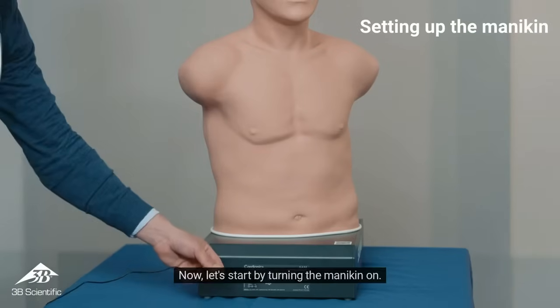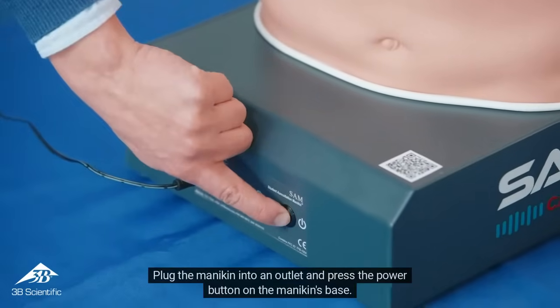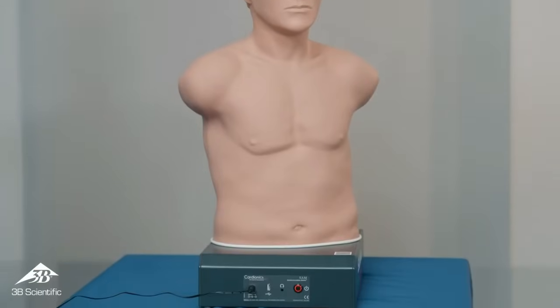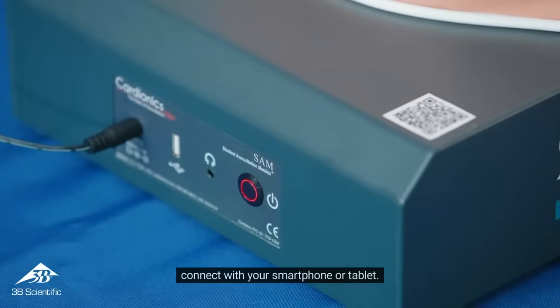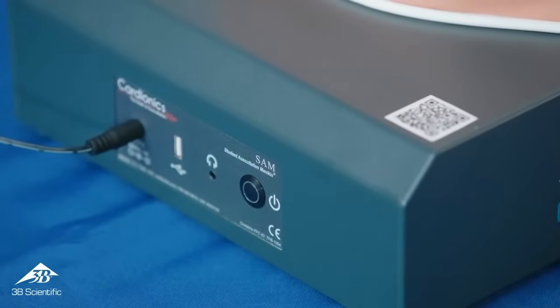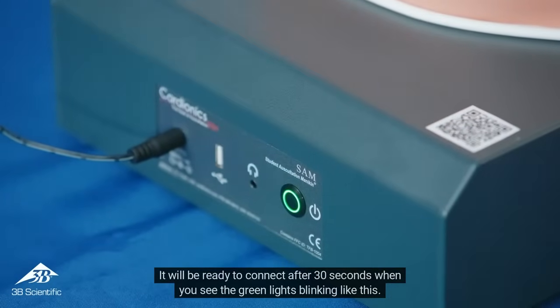Now, let's start by turning the mannequin on. Plug the mannequin into an outlet and press the power button on the mannequin's base. The power button will display a red light, and it will turn green when the mannequin is ready to connect with your smartphone or tablet. It will be ready to connect after 30 seconds when you see the green lights blinking.